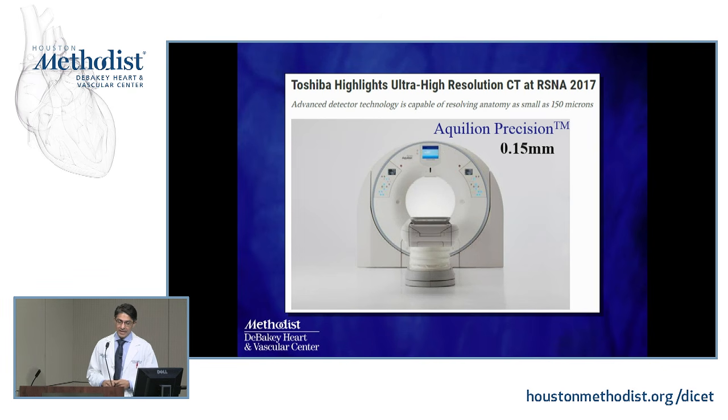This was introduced at the RSNA in 2017. Dr. Chang will probably tell us more when we come to the advanced side of CT. But believe it or not, this is being readily tested in research as of now, and can now resolve down to 0.15 millimeters, or 150 microns. So now you have a technique that has spatial resolution equivalent to the cath lab.